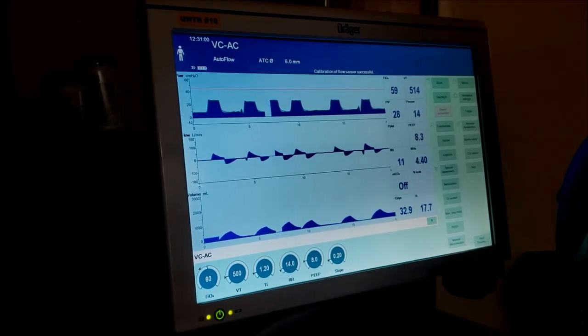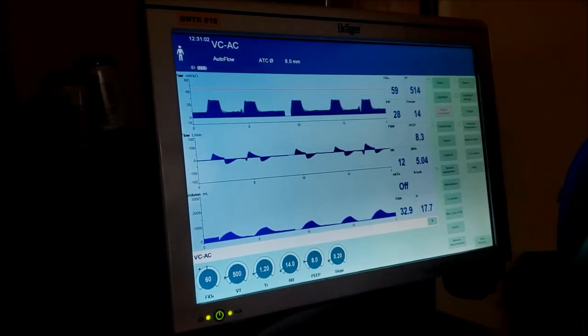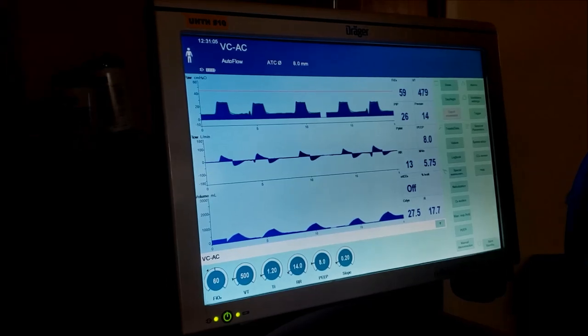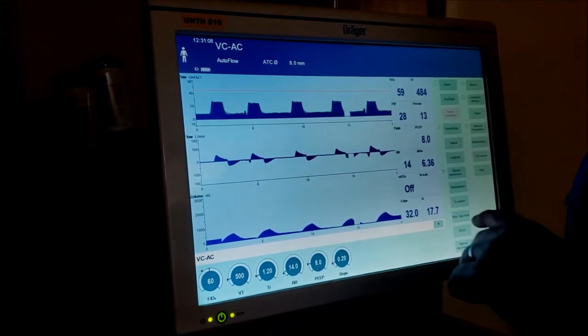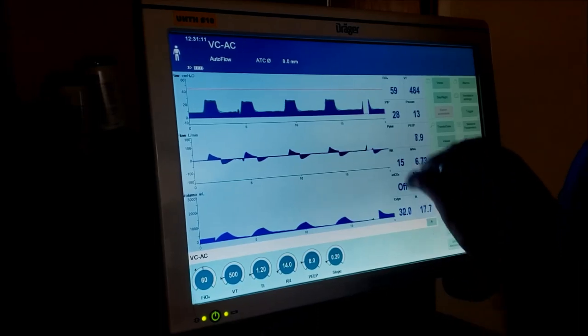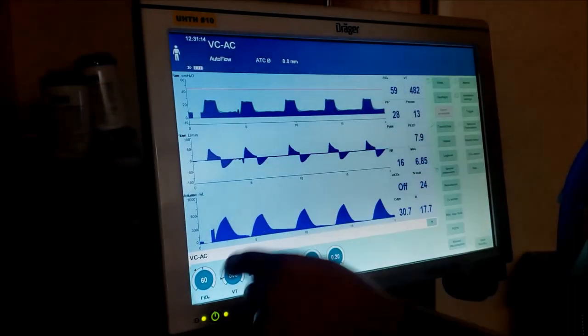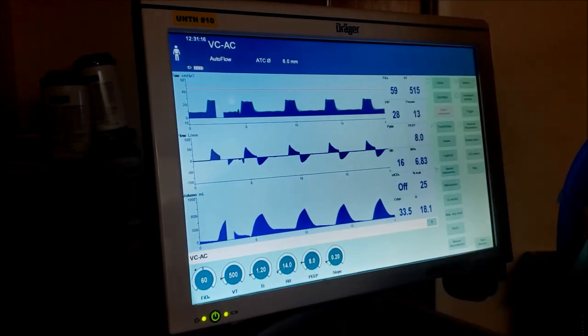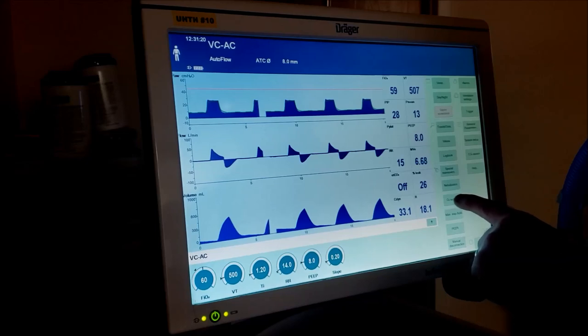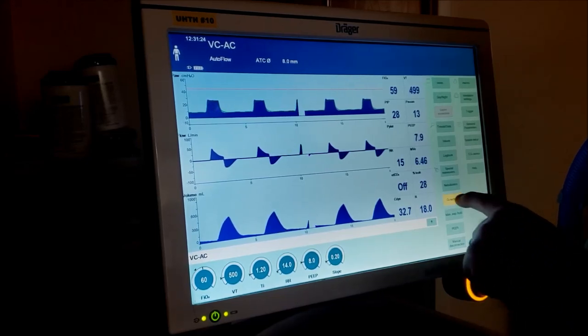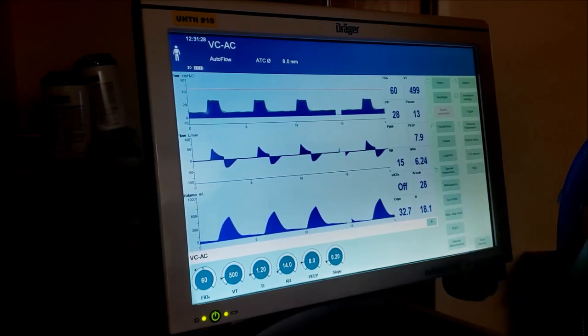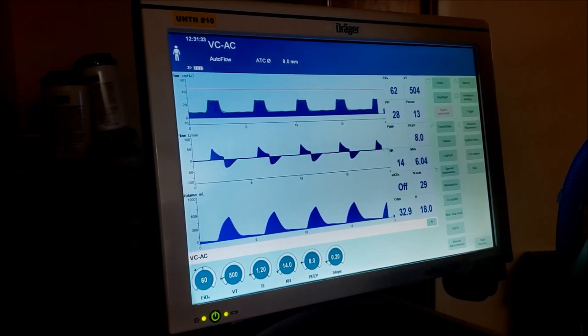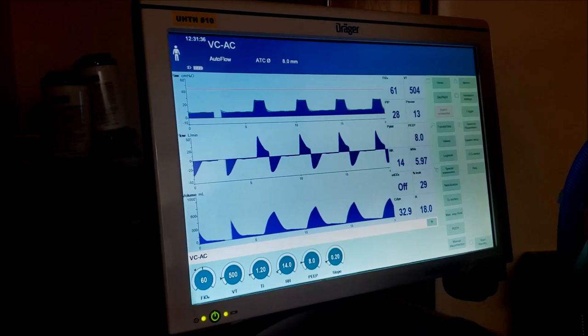This is what I call the resting mode. This control is most likely used if you have a patient that has, let's say, early ARDS or late ARDS. You could be using some mode like this where you're resting the patient. Assist control is the absolute most popular in those cases. If you look over here, this is all your data. This is your settings, this is your data here. Other buttons we use quite a bit - O2 suction, touch and confirm on that. That will silence the alarms and give 100% oxygen while we suction, keeping any chance for them to have any kind of ectopy and things like that.